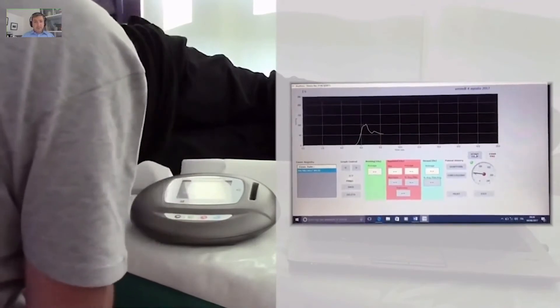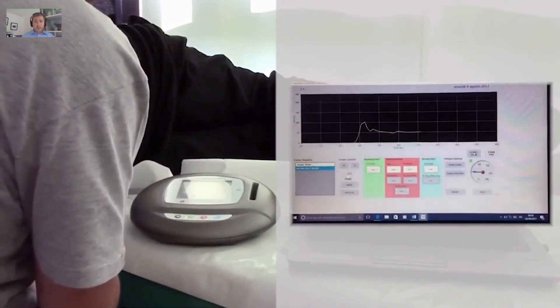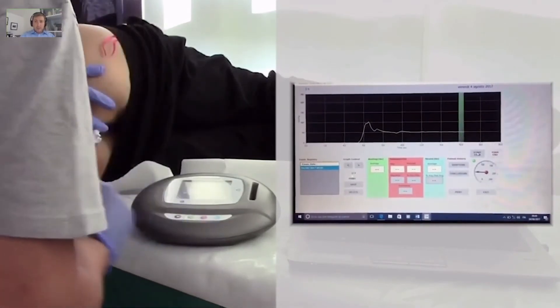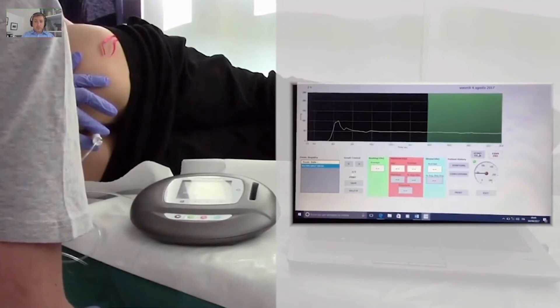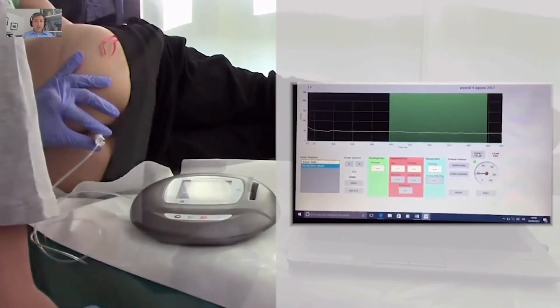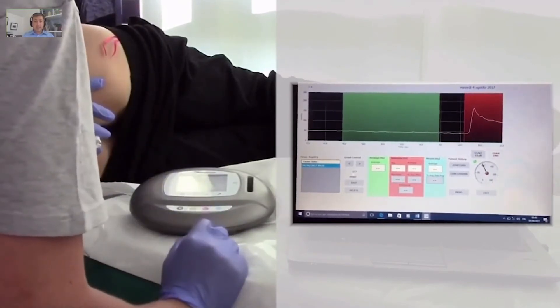This is actually the test itself. Patient is in the usual position on the left side. We introduce the catheter. You can already see the anocutaneous reflex. We wait for the resting pressure curve to stabilize, and we push a green button which records a few seconds of resting pressure. You can set up how long you want to record — 15 seconds, 10 seconds.